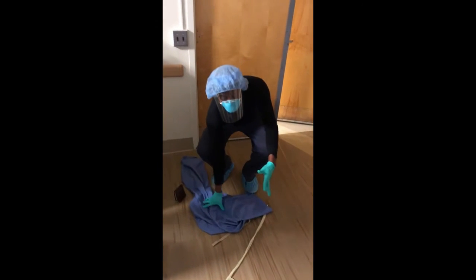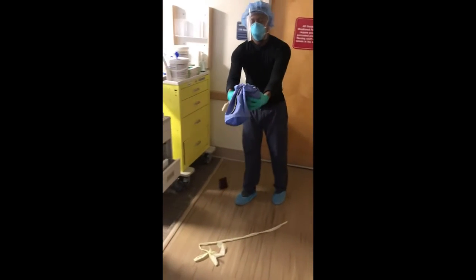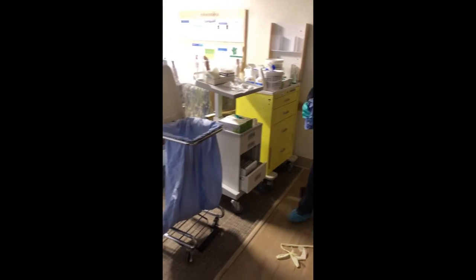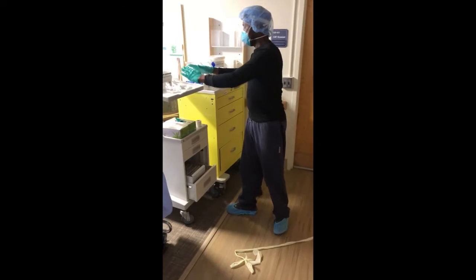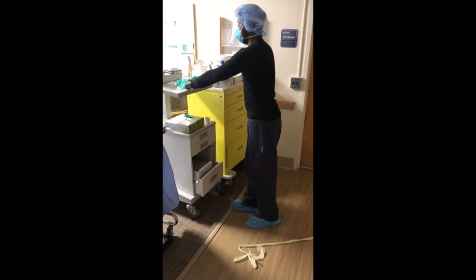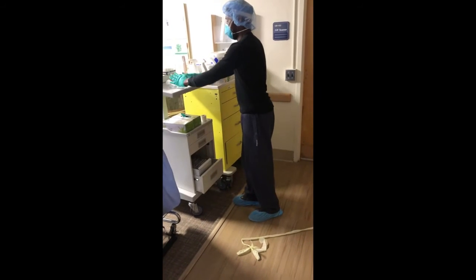Now that the pants are off, holding them away from you, dispose of them in the laundry hamper. Then decontaminate your gloves. After every step, every time you touch something dirty, you're going to decontaminate your gloves.